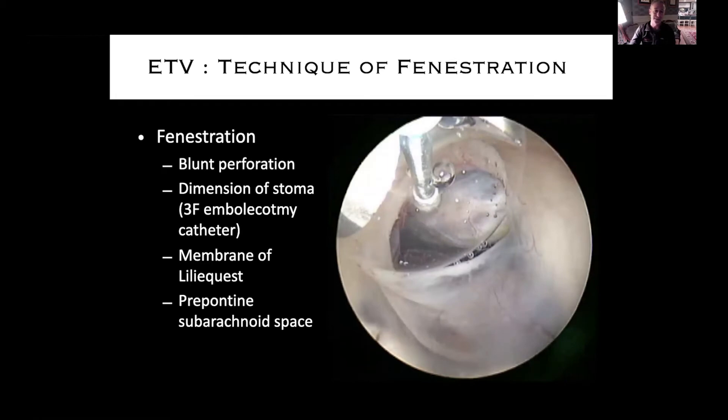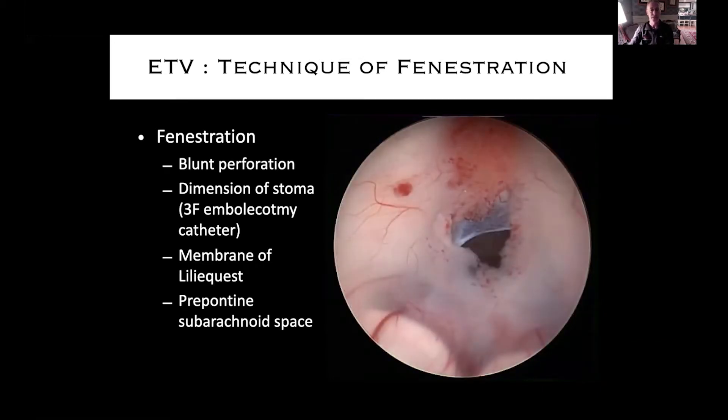Here's a 3 French embolectomy catheter blown up — it looks enormous through the endoscope, but 3 French is really quite tiny. If you're doing one of these cases on a rotation, take it off the field before it's used, blow it up, and look at how small it is. There's the membrane of Liliequist through the floor of the third ventricle. Even if the floor of the third is completely perforated, if that membrane is partially or fully occluded, the ETV is not going to function well and is likely to occlude and become a non-functioning ETV stoma.